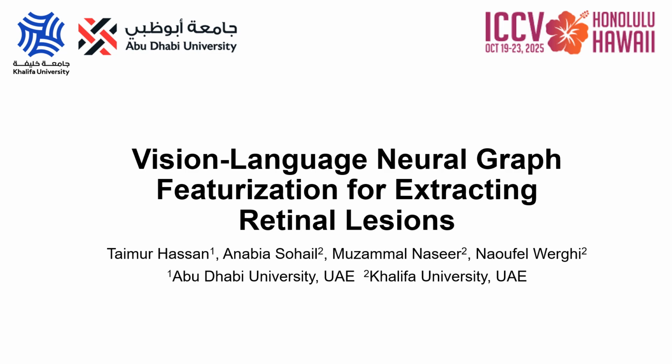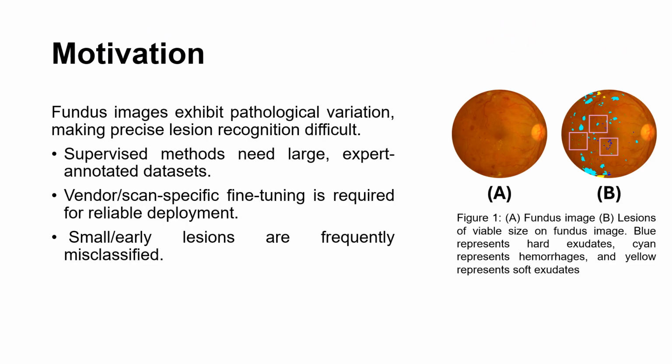Welcome to the presentation on vision language neural graph featurization for extracting retinal lesions. First, I will explain the background and motivation of our work. Retinopathy encompasses a group of retinal disorders that can lead to severe visual impairment or even blindness. Fundus images are analyzed for the diagnosis of retinal lesions.